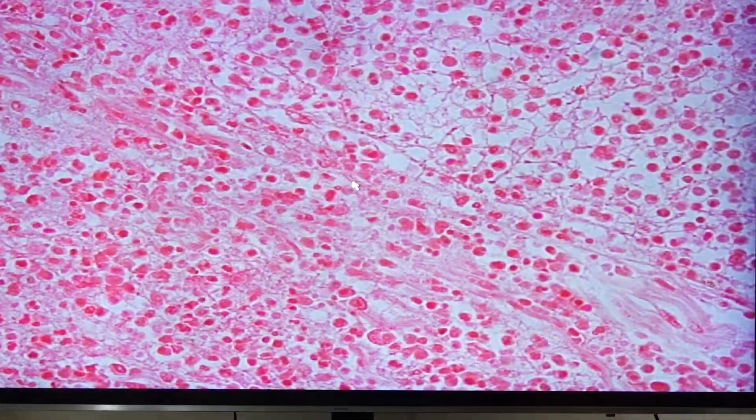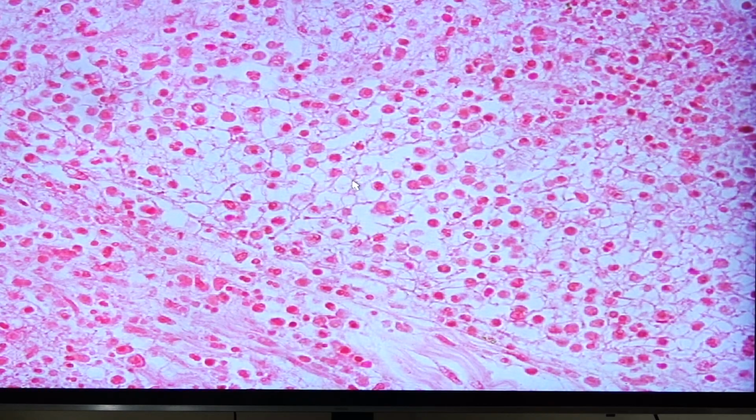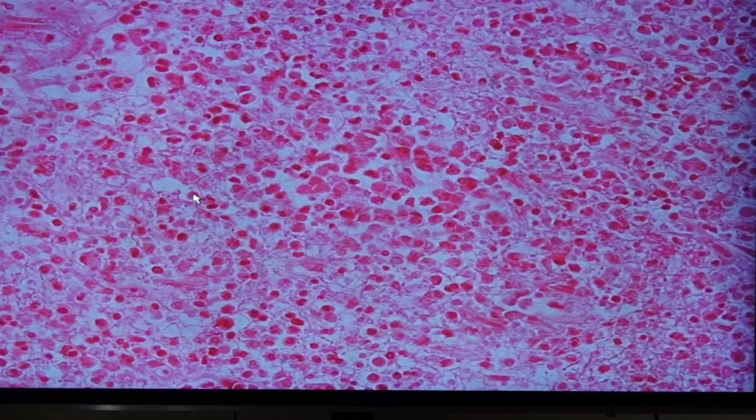And this would refer to a mixture of histiocytes, segmenters. This would be the segmenter. We have segmenter, lymphocytes, histiocytes, segmenter. And there's a mixture already. It is surrounded by abscess formation.